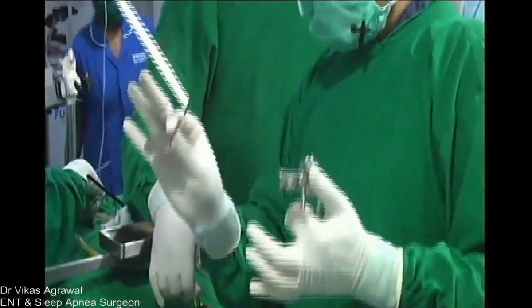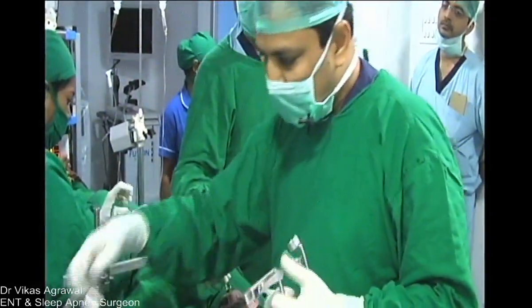45-degree endoscope camera, please. Now, important is that when we put the mouth gag, this mouth gag I am changing. I am putting a smaller mouth gag.